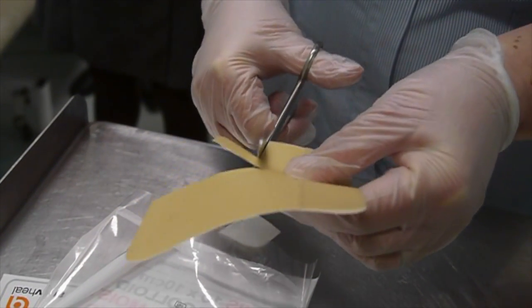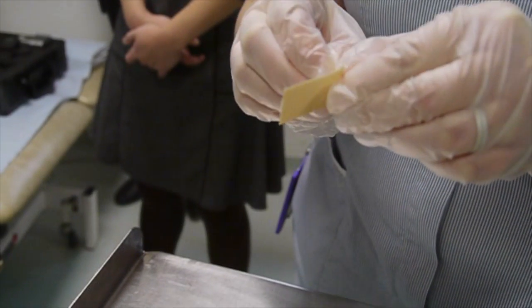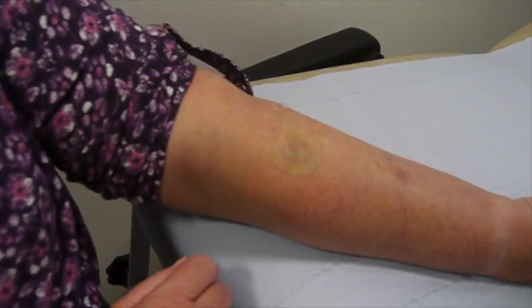A second piece is being cut to cover another area of ointment and eczema. Again the backing paper is peeled off, and now the nurse is going to apply it over another patch of eczema.